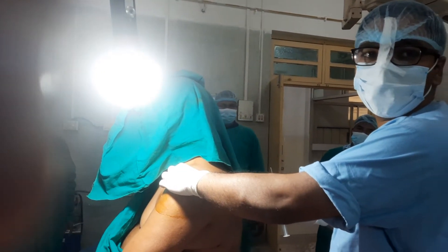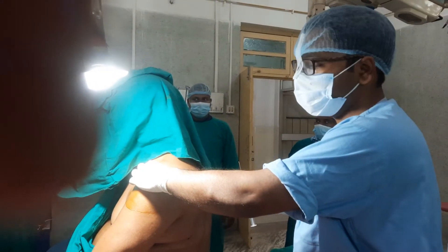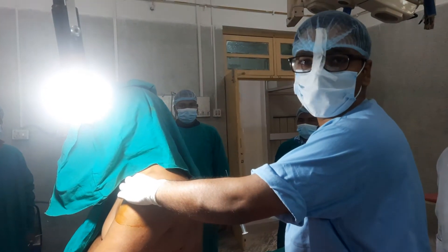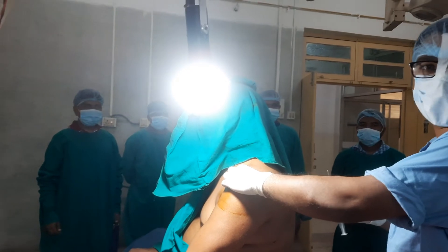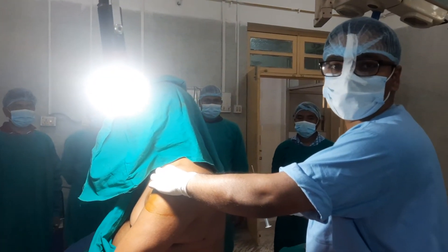Hello viewers, today I am going to demonstrate a very common orthopedic procedure — the subacromial steroid injection in a 40-year-old male patient who presented to us with the complex of supraspinatus impingement.